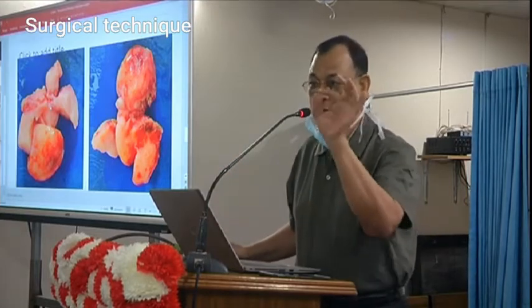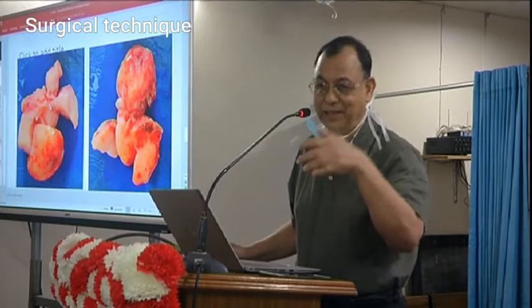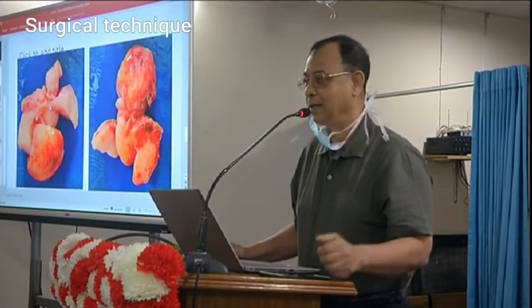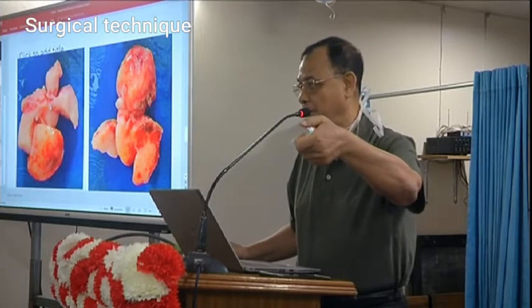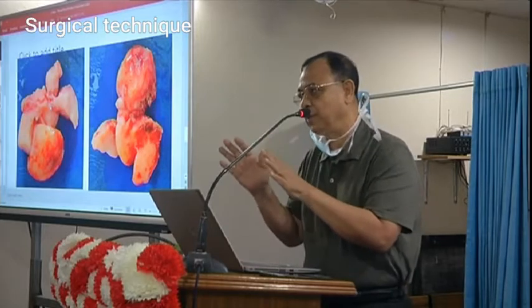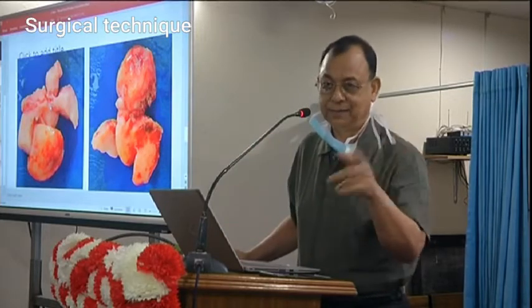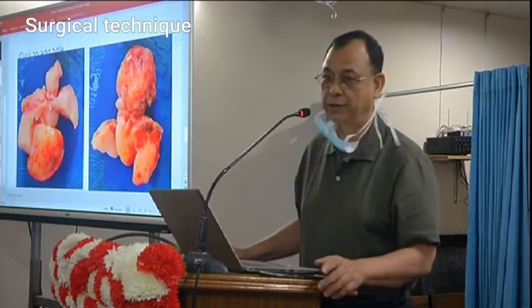You see the sprouting bleeding. That was also controlled by clipping. I have the clipper of my own, so I can use it. Once you have the instrument, you can control bleeding anywhere. So, sir, one thing is very important: exposure is very important.